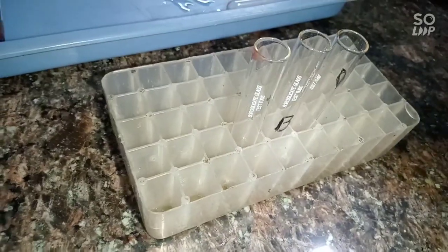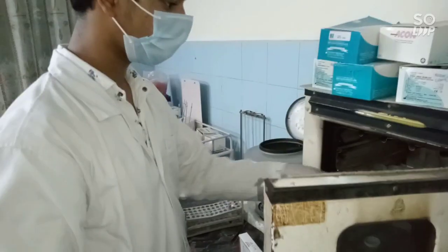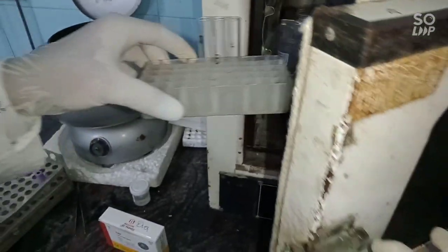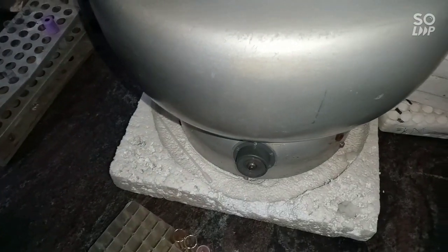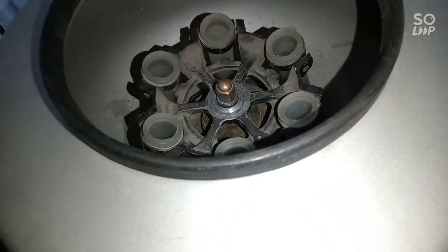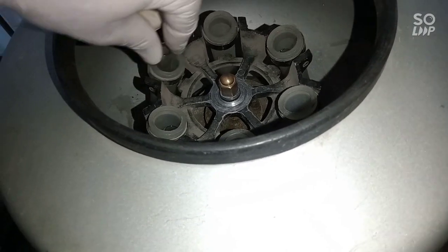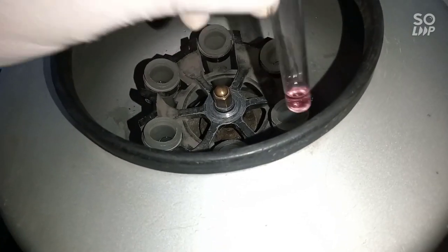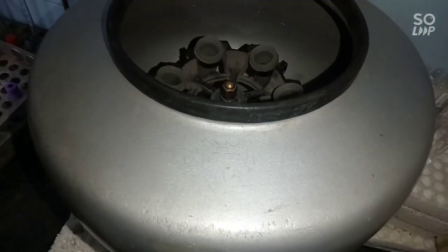Then incubate the tubes for one minute. After one minute, centrifuge the tubes for one more minute at 2,000 RPM. We are doing this for getting the best results.